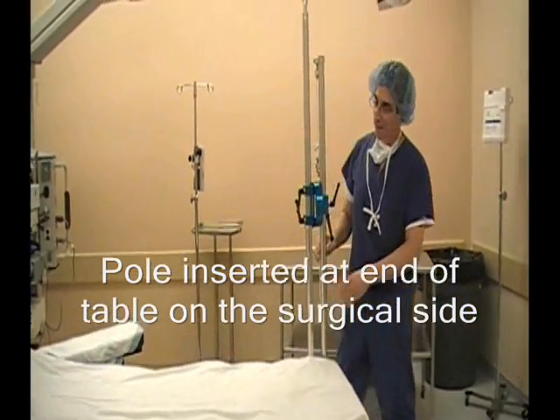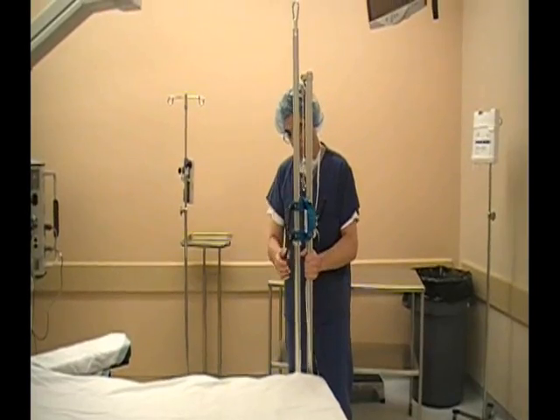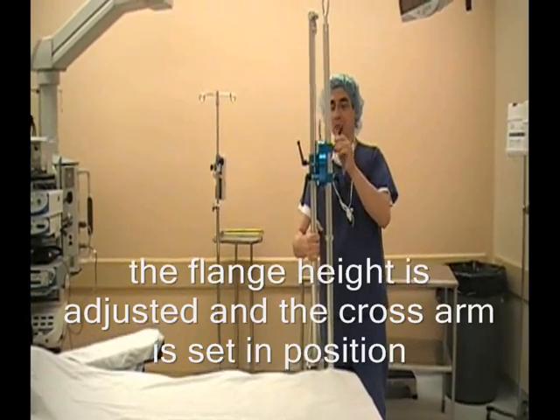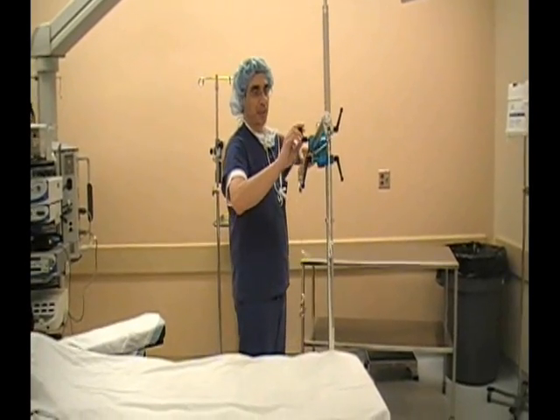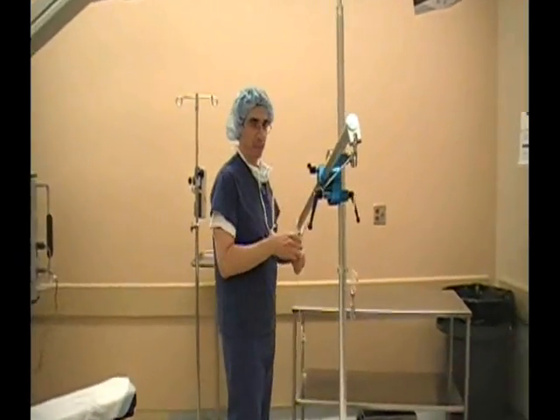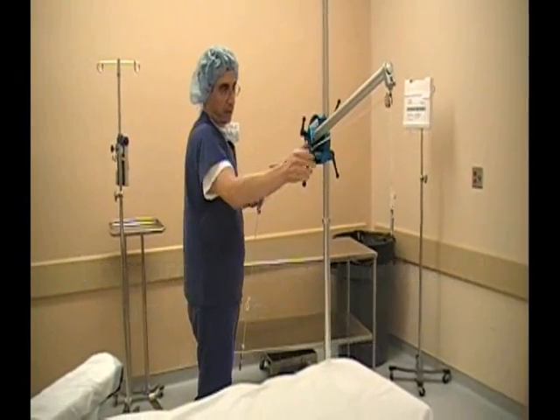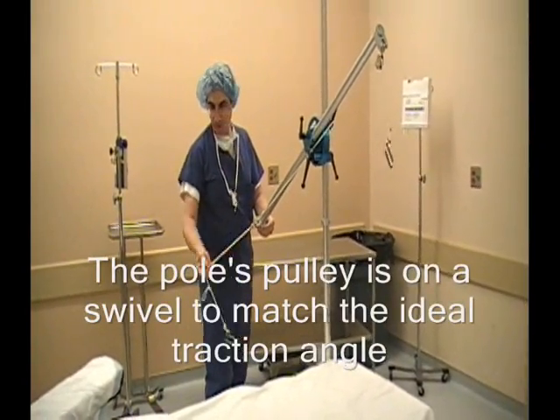The beach chair position — the pole is at the end of the table, and I want to turn this around to get the tube in the right direction. I'm going to set the pole. Let me just turn a little bit towards this side so we can see it. A reasonable length to accommodate the length of the patient's arm, and these swivel to manage the direction of the pole.